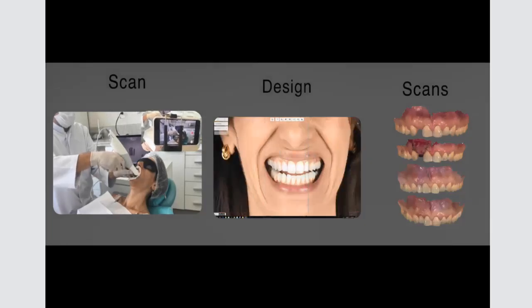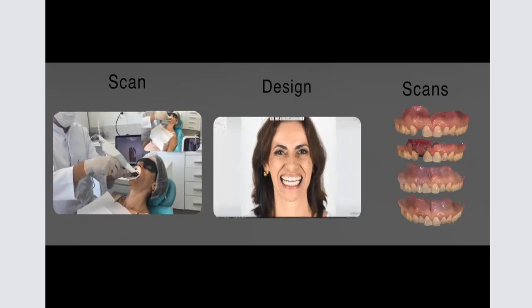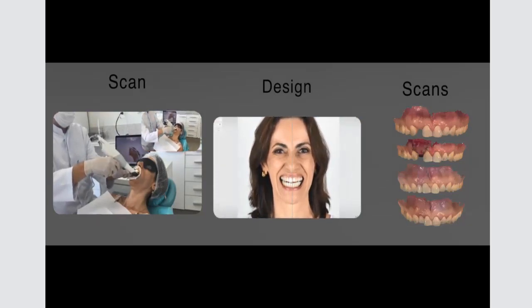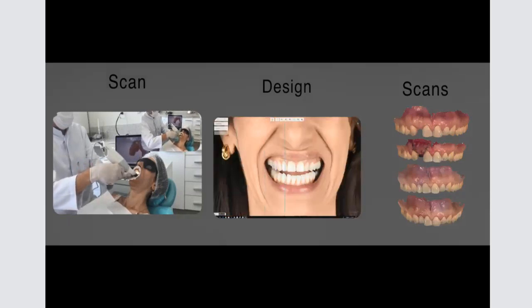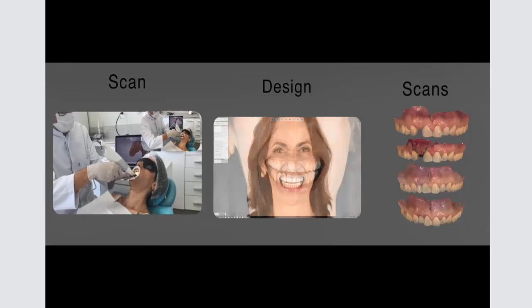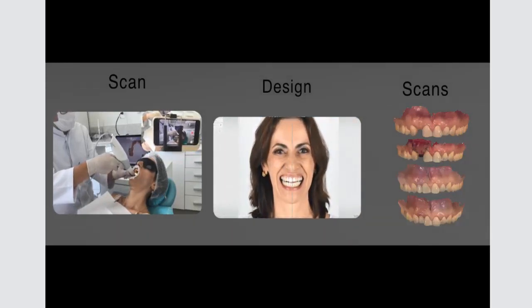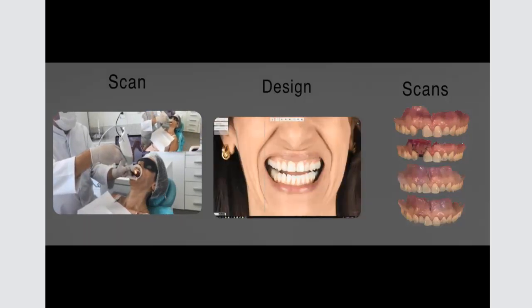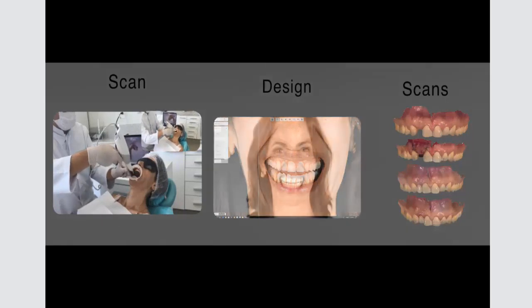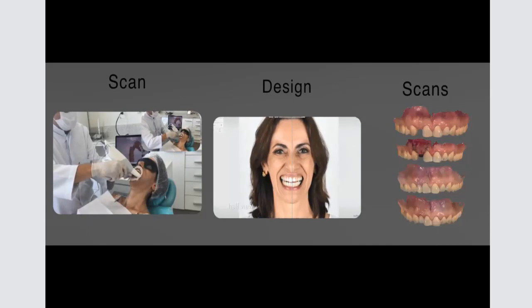Here is pretty much one thing that I like to show, regardless of whether it's an implant, a restorative, or aesthetic case. The patient comes in, I scan, or the assistant scans, and we also go for some design, very simple. The last webinar about smile design can give you that, in a few clicks. You can have a proposal that gives you a sense of where you are. You're not saying that's the treatment the patient will get, but you are just giving a hint that things can be done. And then you do multiple scans during the treatment, from the beginning until the end.